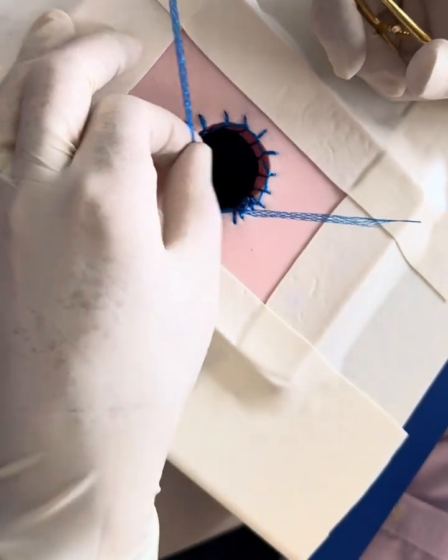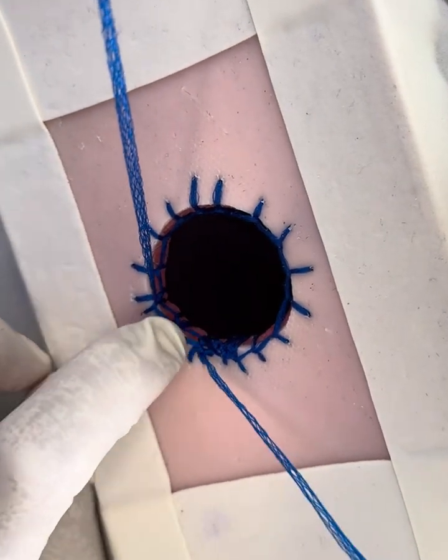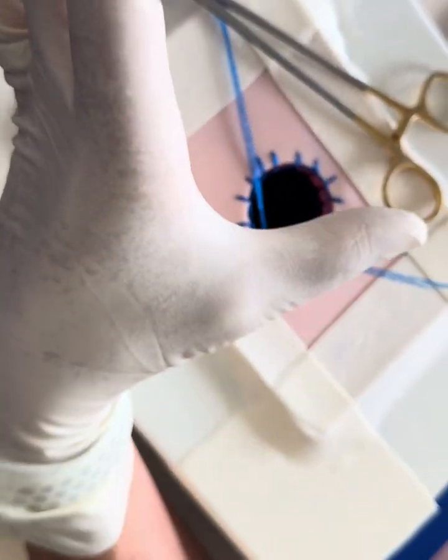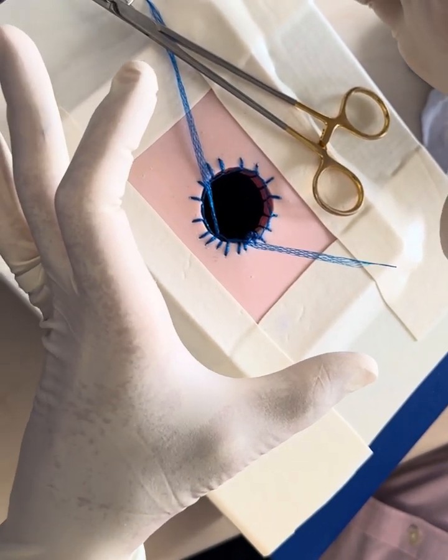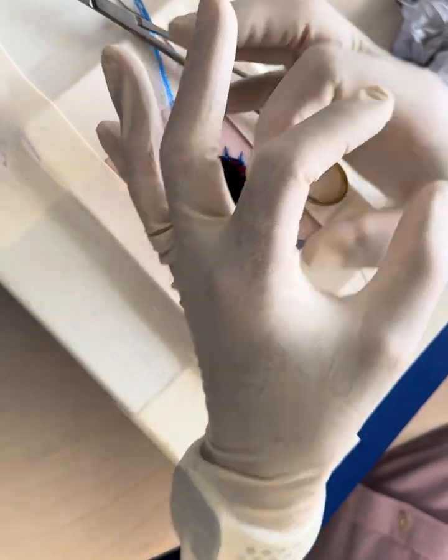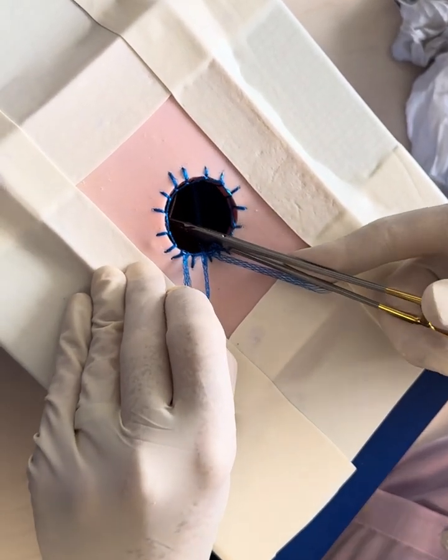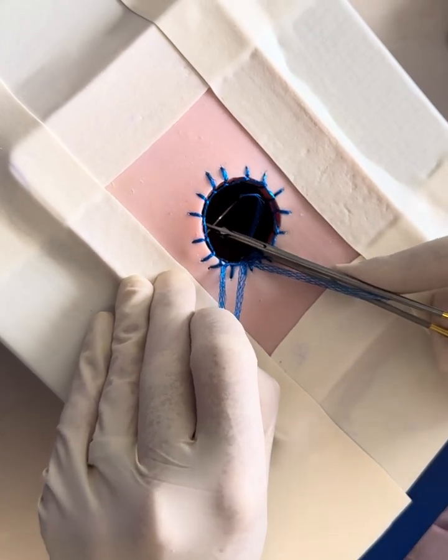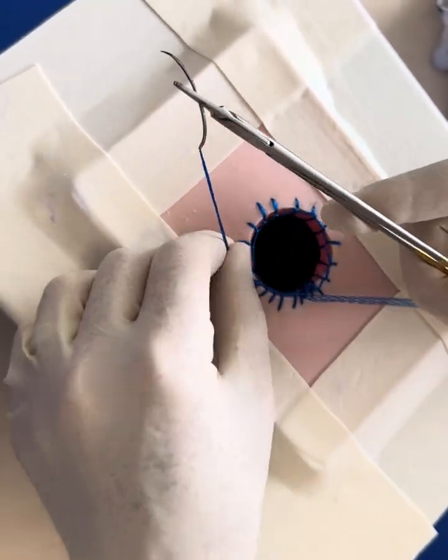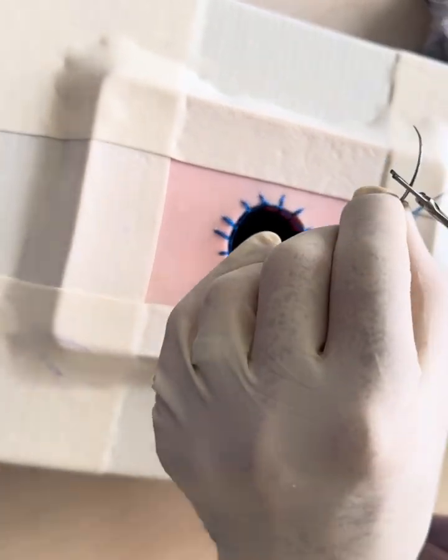And what this does is get more mesh into the tissue, but even on this model you can see it's now holding the Duramesh right up against the muscle edge. You're getting more Duramesh, you're getting a lattice work to reinforce. And if you have got that big defect, I've managed to reduce down a 15 to 16 centimeter diameter parastomal defect down to a 3 centimeter defect. And it has had an absolutely perfect outcome on a very troublesome parastomal hernia in a patient post-cystectomy who was getting lots of episodes of bowel obstruction in and out of hospital, and a football-sized hernia which is now repaired and functioning beautifully.